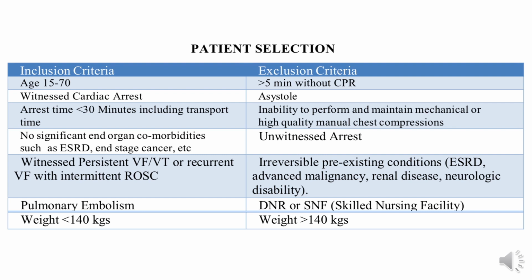And Angie talked about the need for us to have a little bit of time once you get to the emergency department to get them on pump. Cannulation is not exactly an easy thing to go through, so we need a little time. So the sooner they can get there, the better. But we've set the out-of-hospital time from cardiac arrest at 30 minutes.